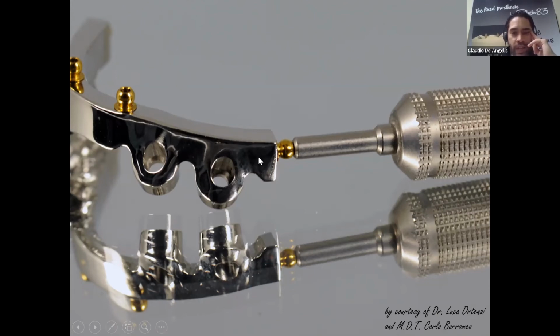You have a thread inside your bar. The microsphere, you can use it in a vertical way, but also in a horizontal way. In this case, in the vertical, you use the Otica microcaps. In the horizontal, in the distal area, you can use the OT Strategy cap.